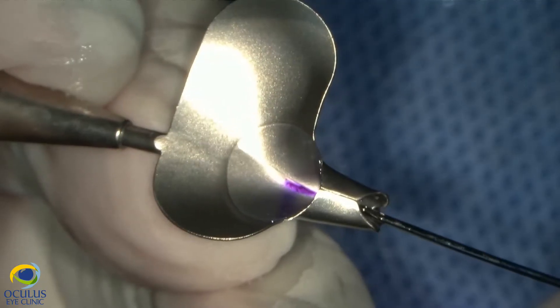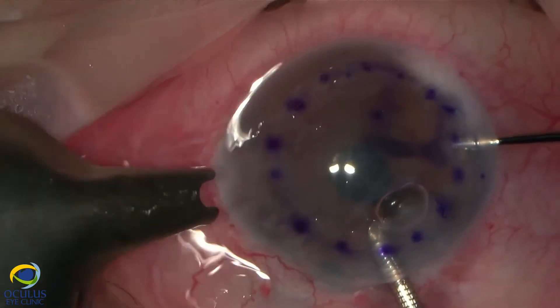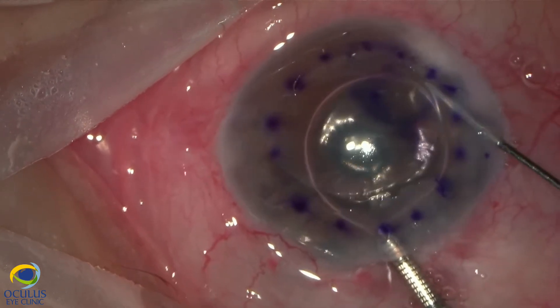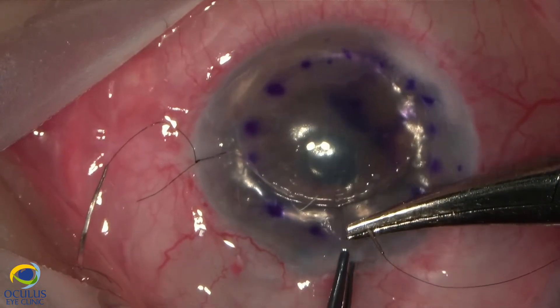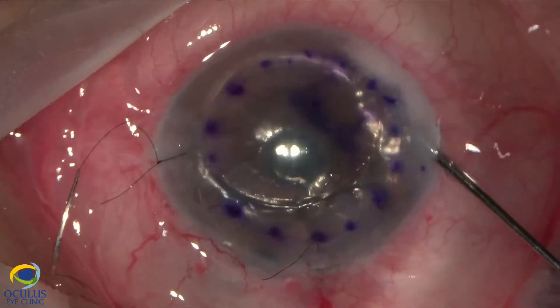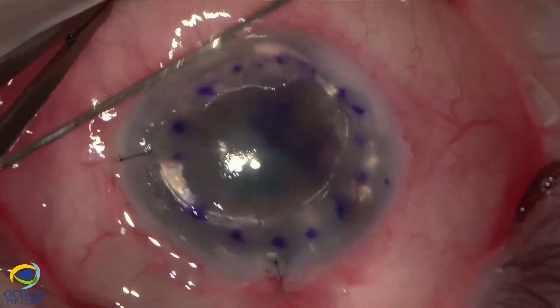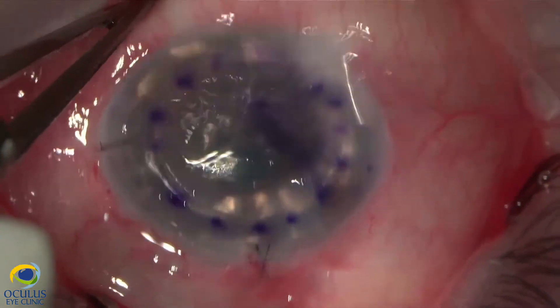The DSEC lamella is prepared in the OR using an artificial anterior chamber, and with the help of the Busin glide we inject it into the anterior chamber via a 3 mm limbal incision. It is now in the anterior chamber with an air bubble beneath it.